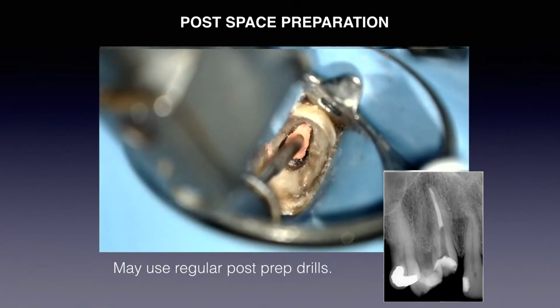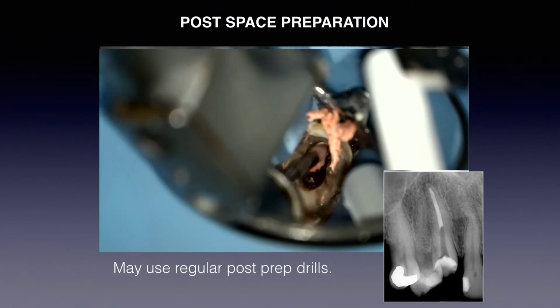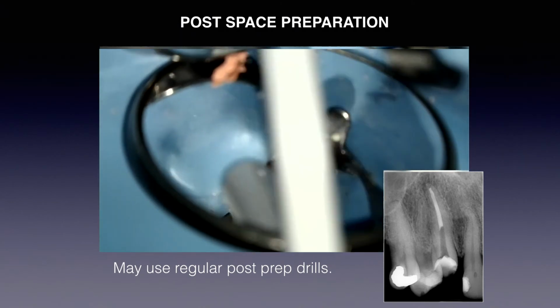Well, here I'm using a piezo reamer. Use whatever you have. Don't go out there and start buying a whole new kit for just post-space preparations. So whatever you have, use it. That's it. It is Guttapercha. There's no catch or gimmick, remember?